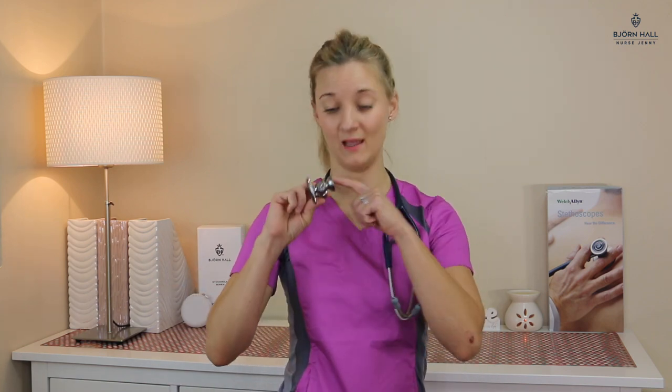Same goes for the ear tips — they are also screw off and on and you can lose them as well. The ear tips are for my liking too hard and too small. I also find that I keep readjusting the tension of the binaurals as it doesn't stay where I've adjusted it previously, which is quite annoying. So who would this stethoscope be good for? I wouldn't personally recommend this stethoscope to a student nurse, a new nurse, or any nurse unless you are a cardiology nurse who likes this unique trumpet style. The money that you pay and the value that you get just isn't there.